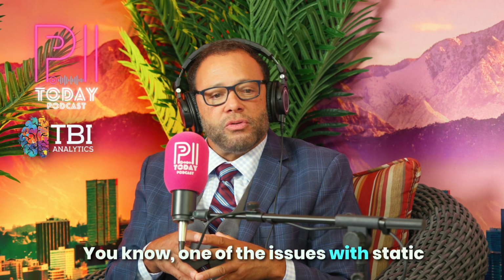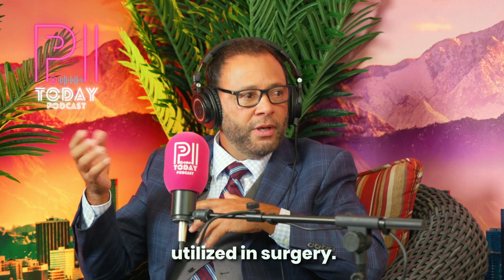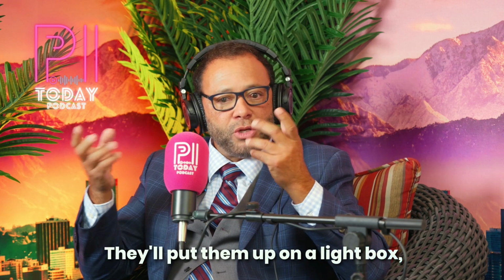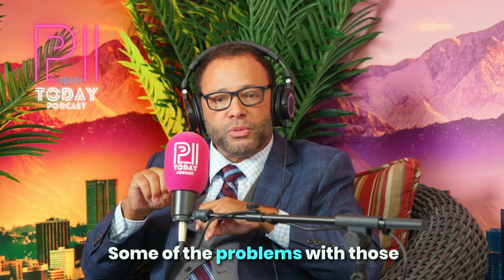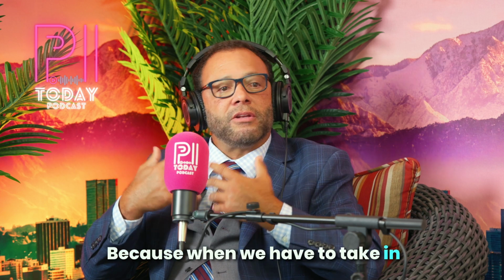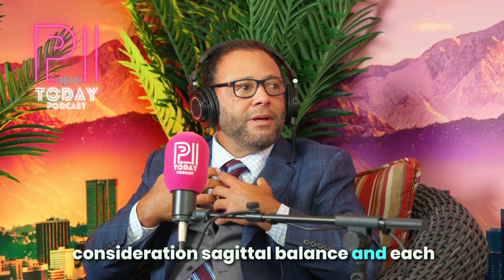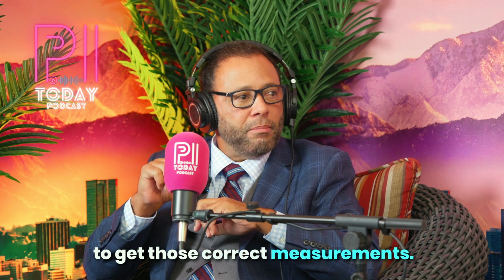One of the issues with static images is that a lot of times those are utilized in surgery. They'll put them up on a light box, measure out sagittal balance, and get their measurements, pelvic tilt, PI minus LL. Some of the problems with those measurements is that they're incorrect, because when we take into consideration sagittal balance and each patient's unique anatomy, it's important to get those correct measurements.